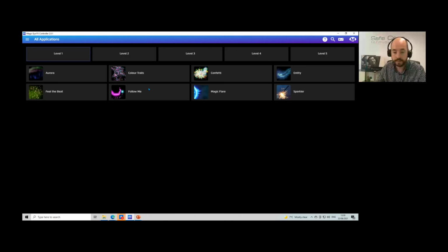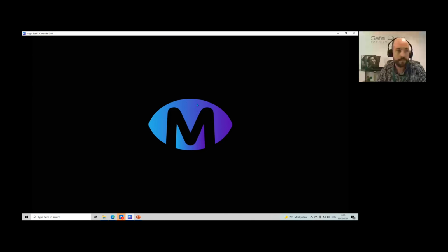And again, going back to the menu just to show you the other features. Apologies, I pressed escape by accident. Okay, so once that opens up, I'll be able to show you the menu there now again. Okay, so F8 again. So yeah, we have the power, we have the settings. Okay, and we scroll up a bit more. Okay, and we have the dwell time, so we can do the dwell time from the actual menu as well.